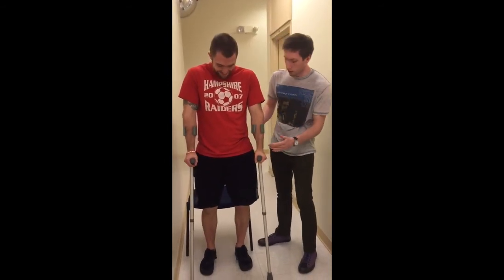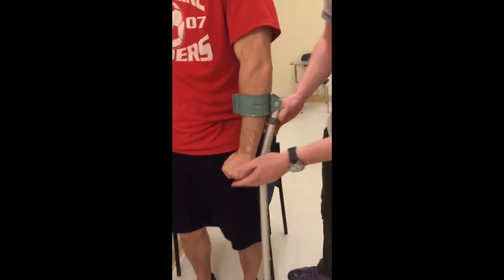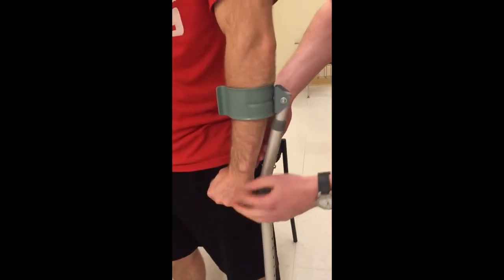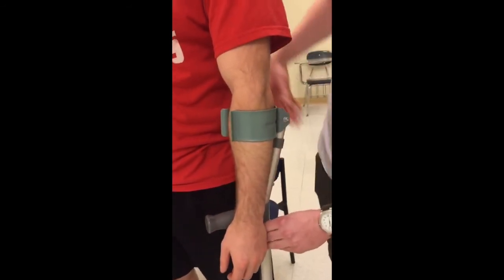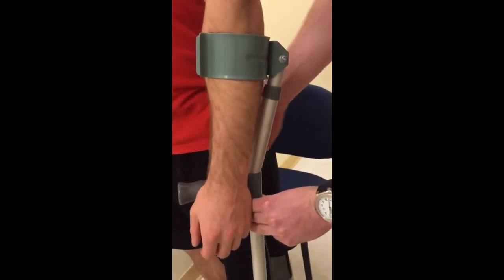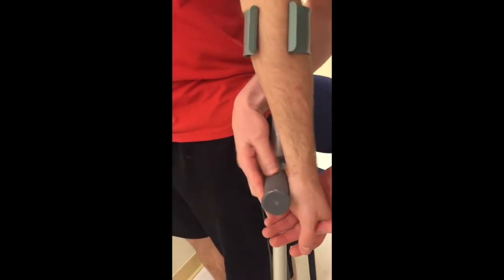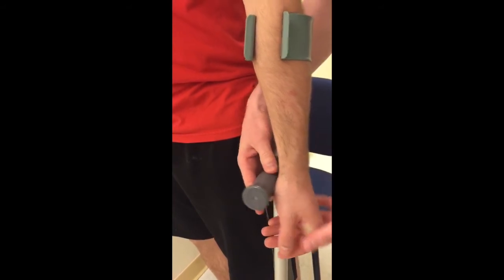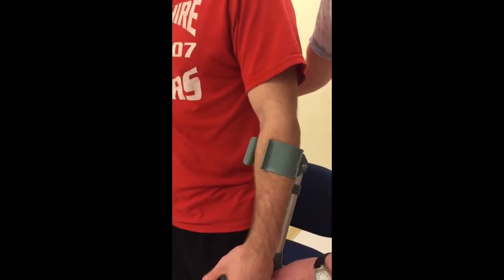So now what we're looking for is, again, similar to the axillary crutches, we want to do the styloid process rule of thumb. Make sure the patient's standing up straight, or else that's going to fudge the numbers. So you can see how this can kind of come down a little. The wrist crease is pretty high up. Okay, so we're going to do that for both of them. Changing one thing at a time.